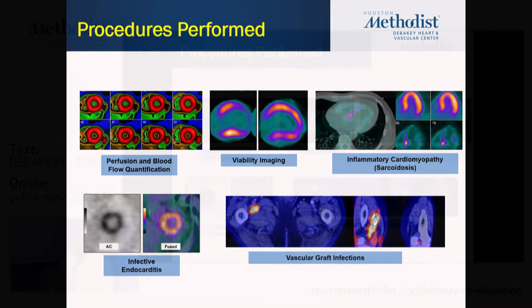Although it's one of the areas where it is less studied, because most of the time, by the time the metastasis reaches the heart, the patient already has a tissue diagnosis. But in terms of masses, initially, yes, it will be very helpful.